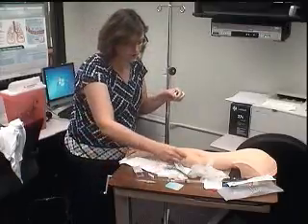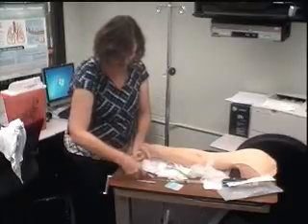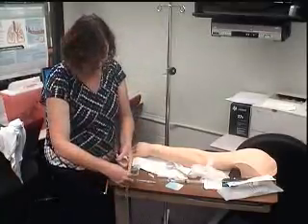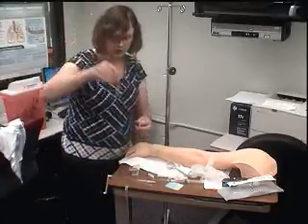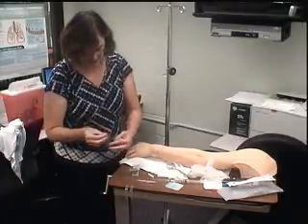If you work at a facility that you can't, you just open it up and you put it inside your container. Inside, you can use your tape on the inside of this. Okay, but I'm going to put it on the edge of the table because I'm going to be putting this tape on top of the dressing, not underneath the dressing. So I tear it in half, about this long, and then tear it in half, okay? And then maybe another piece.